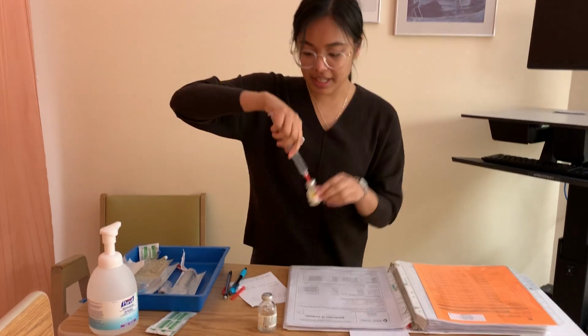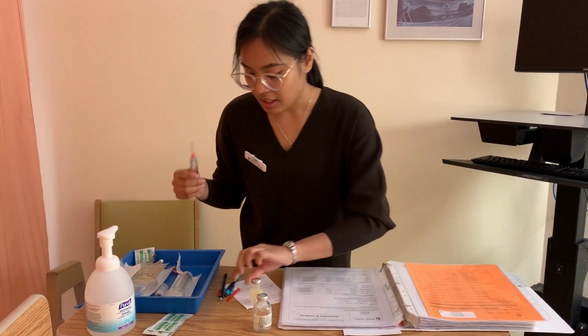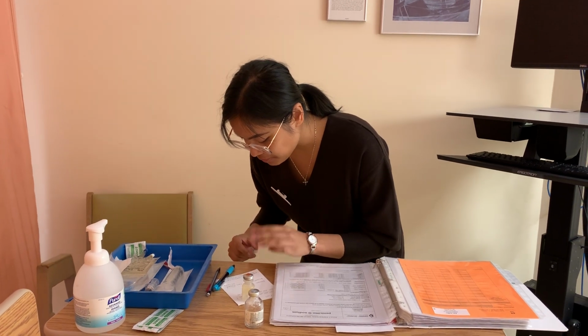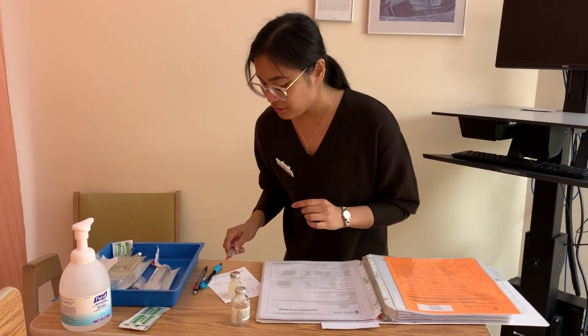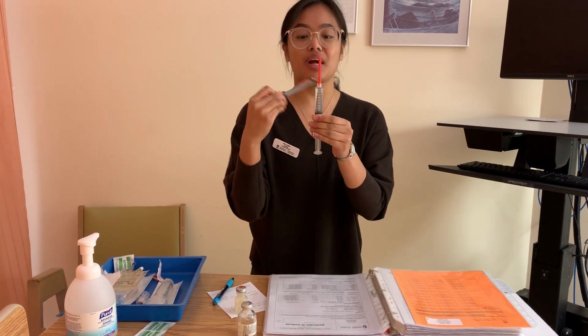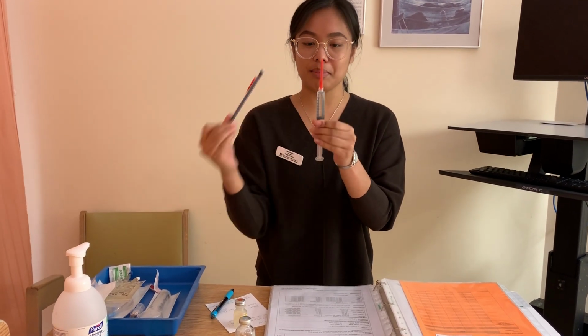Just going to pull up a little excess, and I'm going to put my cap back on using the scoop method to maintain sterility of the tip of my syringe and to ensure that I'm not doing any needle prick injuries. I'm just going to tap to get rid of air bubbles to prevent any air embolisms that can cause pain or discomfort for my patient.